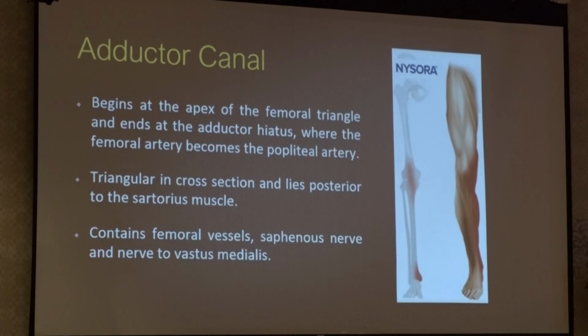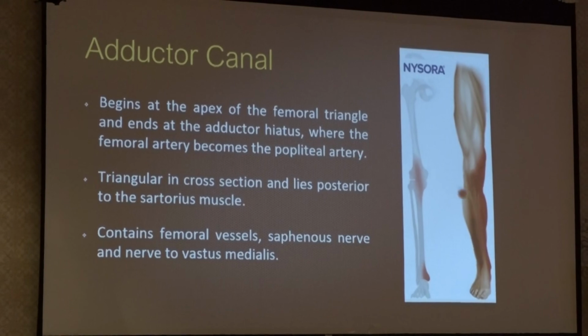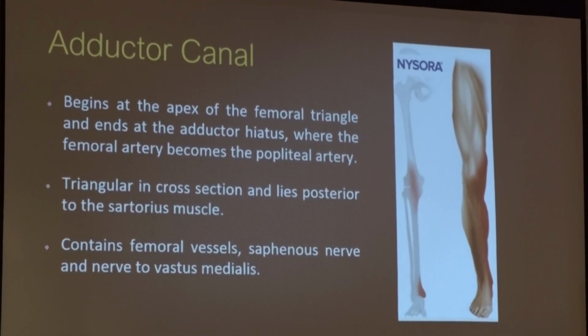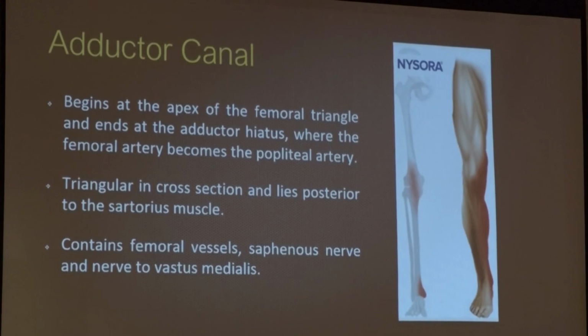If you do this block, the coverage is at the knee, the medial aspect. Let me see. Medial aspect. Can't really see the pointer here. Medial aspect up to here. All right.